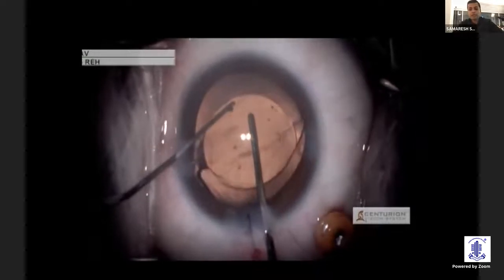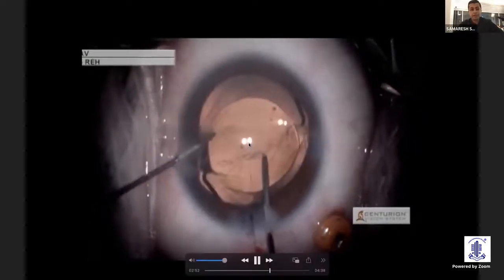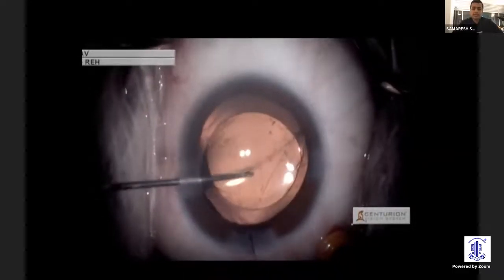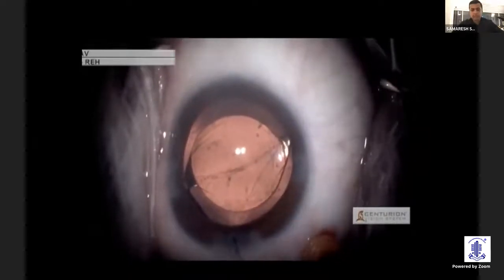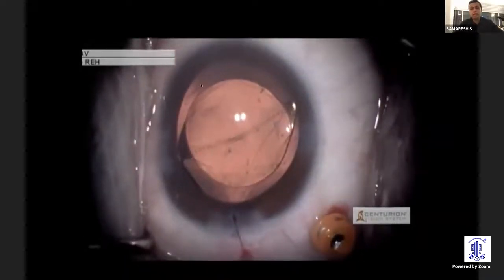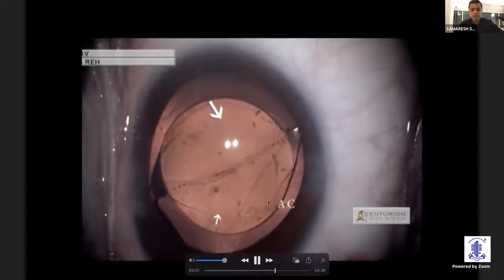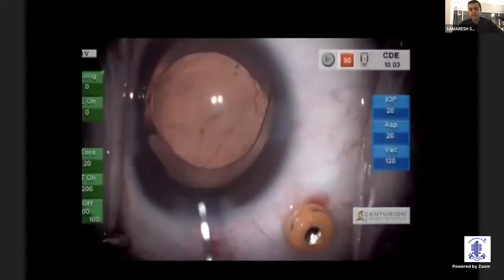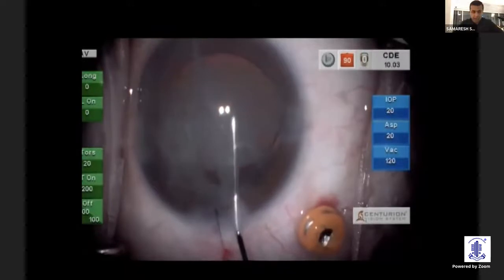Now, like the previous surgery we discussed, I put in a toric IOL and dialed it into place inside the capsular bag by enlarging the incision and going slow with the manual delivery. But I decided to do a reverse optic capture in this, where the haptics are inside the capsular bag, but the optic is prolapsed out of the anterior capsular margin so as to lock the lens into place and make sure that it's dead stable and does not tilt, decenter, or dislocate later in life.